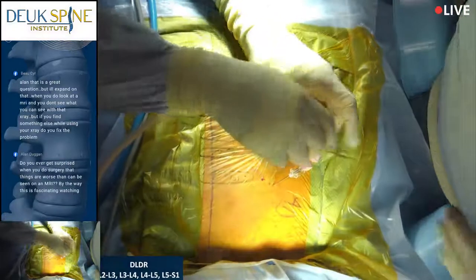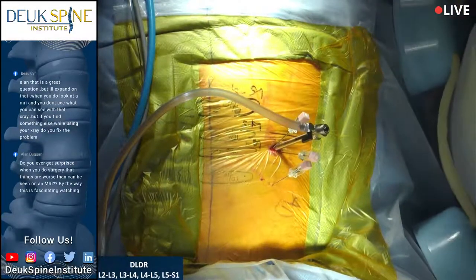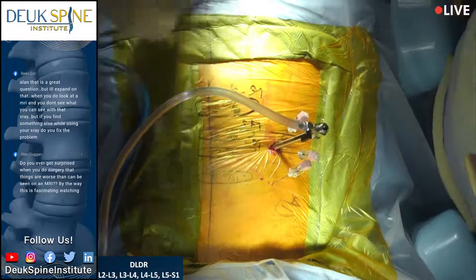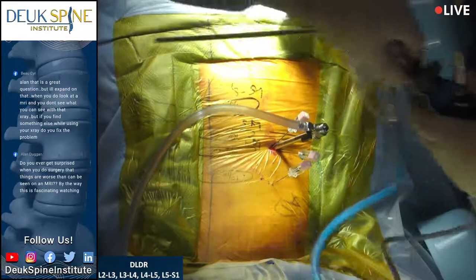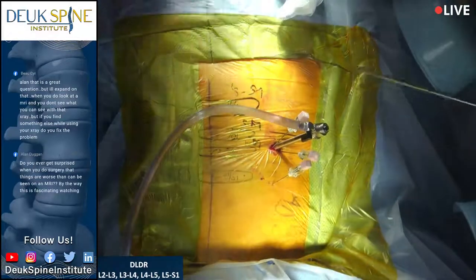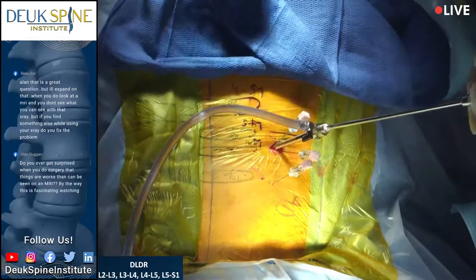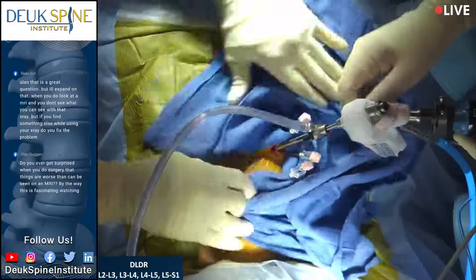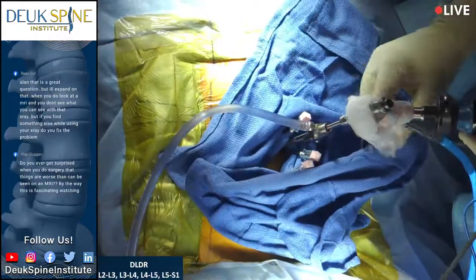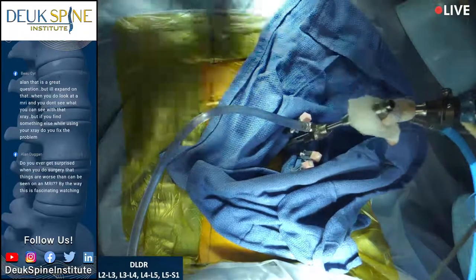Yeah. So we were just talking about this patient, and it's worth mentioning, everyone thinks anesthesia is the same, but it's not. For every patient, it's different. And some patients, doing the anesthesia is more challenging. This patient is a challenge anesthetically, and a lot of it has to do with how sensitive the patient is to the drugs we're giving. All right, I need to see the scope view.